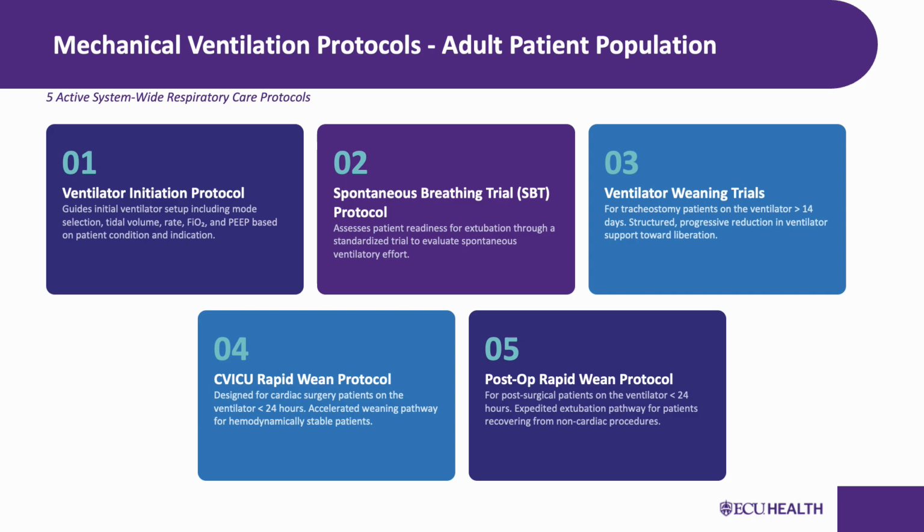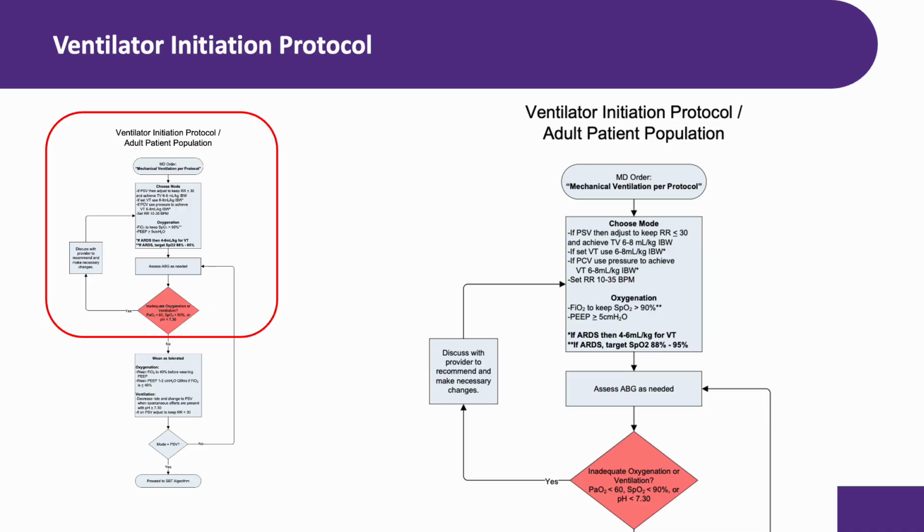Let's go. All right, here we go with our first protocol algorithm, the ventilator initiation protocol. Before anything else, remember that a physician needs to place an order for mechanical ventilation per respiratory protocol in order for us to utilize the ventilator management protocol. Without that order, we're not on protocol. So that is always step 1, verify the order is in place. Now, let us walk through this flowchart from the top.